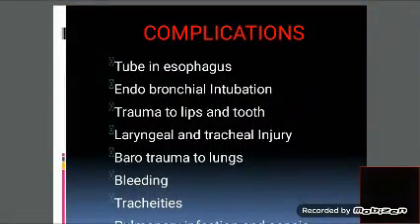Now, a careful watch for complications. Sometimes, if we are not placing the tube correctly and not checking for the proper placement of the tube, the tube, instead of going into the trachea, goes into the esophagus, or endobronchial intubation happens.